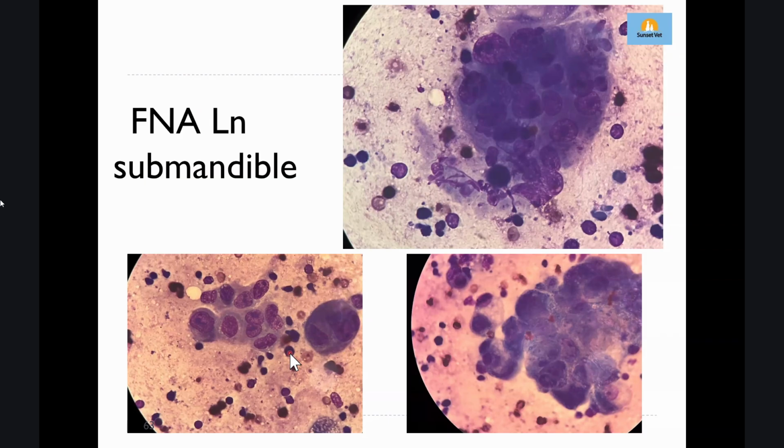Just remember, if it's only inflammation, you have to see the beautiful neutrophils. Is there any neutrophil or not? If you do not see a lot of neutrophils, just ignore it. It's only the naughty neutrophil, so just go to your place. But from all this picture, it's more toward cancer.